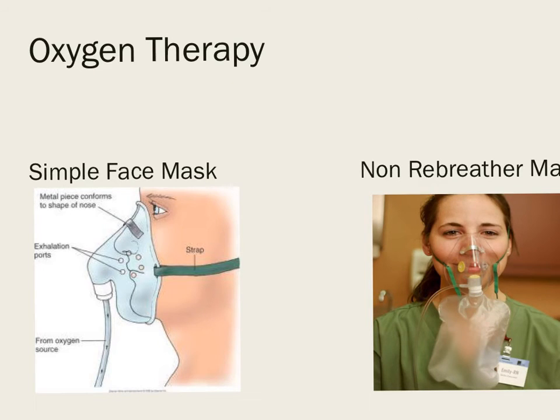The simple face mask just fits securely over the patient's nose. The strap goes behind the head, and you have exhalation ports. Don't ever cover those exhalation ports up. That's how the patient gets rid of the exhaled gases. Simple face masks typically are run at about 5 liters. They're simple, they're lightweight. They can also be used with humidification, which will increase patient comfort.